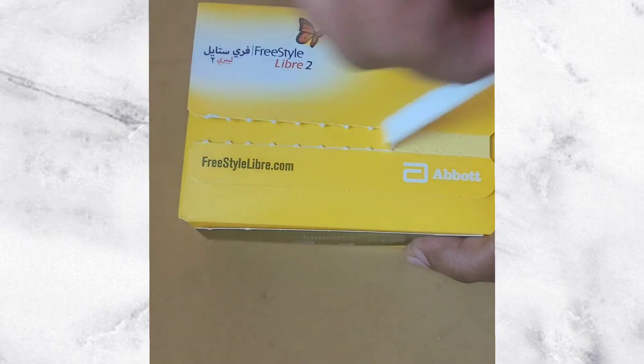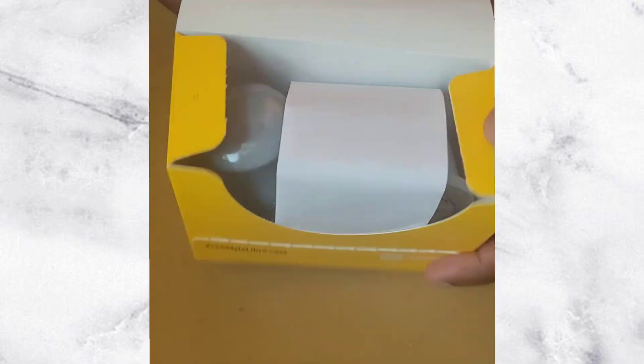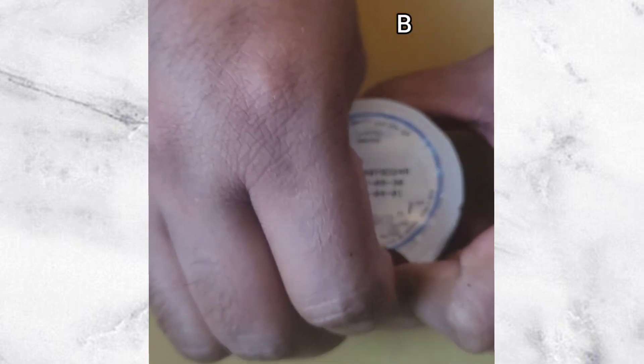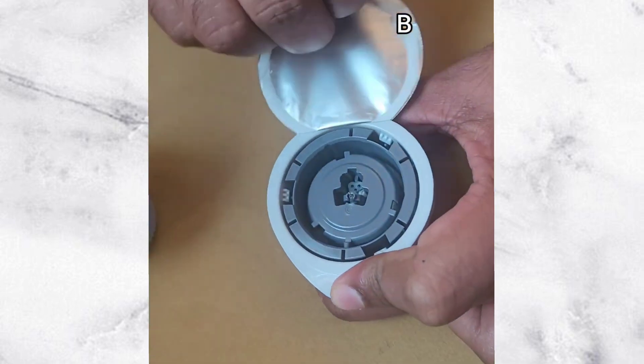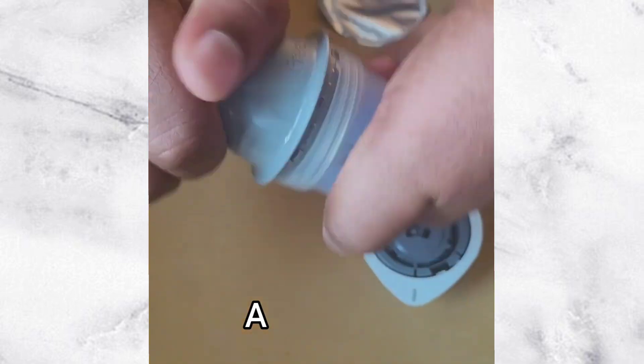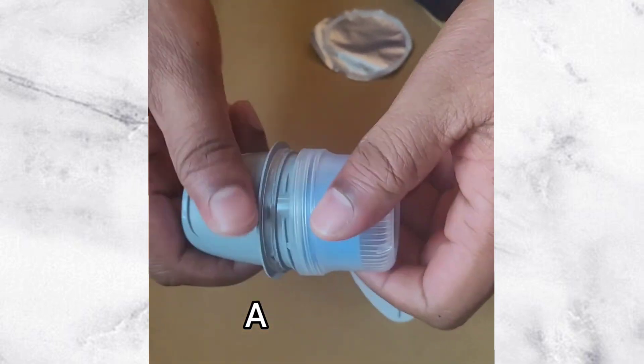The Freestyle Libre 2 sensor has two components — let's call them part A and part B. First, peel the lid of part B and then unscrew the cap of part A. This is the sensor applicator. You will hear a click when you unscrew the cap.